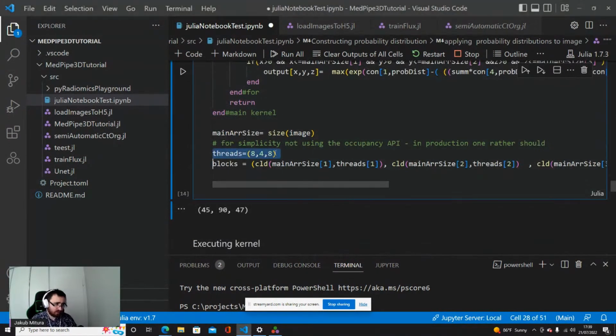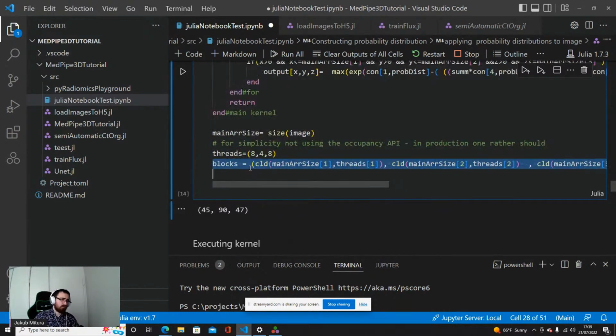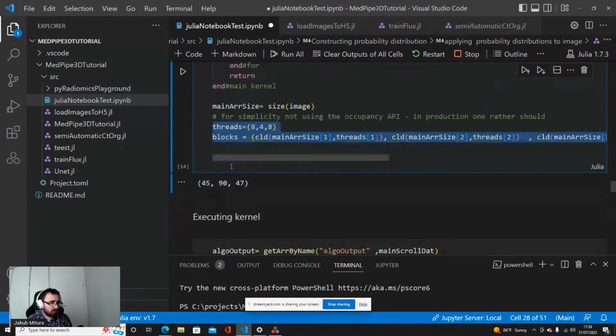So we need to decide how many threads and how many blocks we need to execute. In practice, in production, one should also use the occupancy API that gives us the best possible threads and blocks configuration, but today, for simplicity, I omitted it.